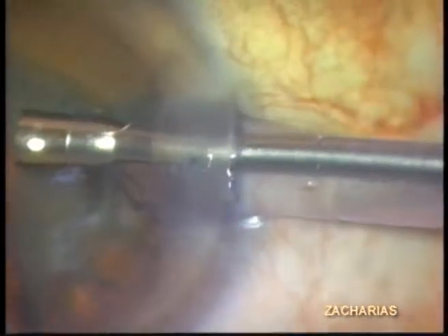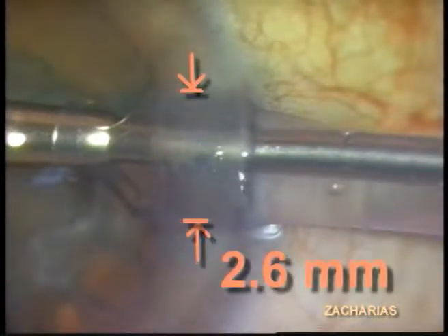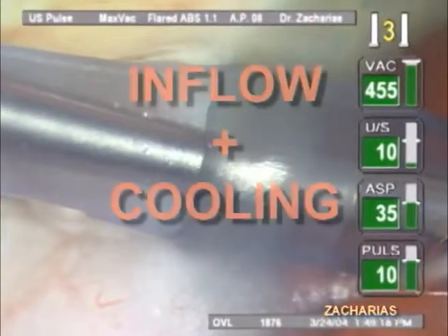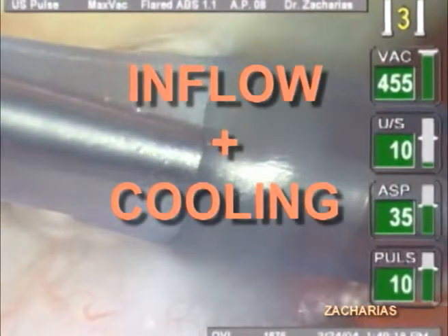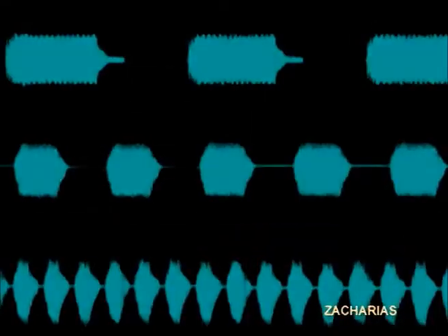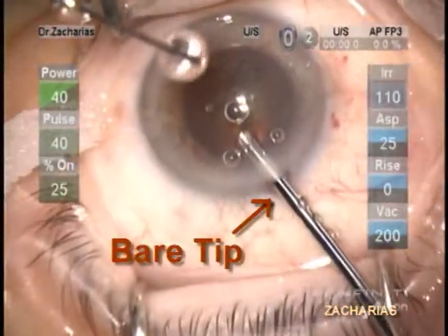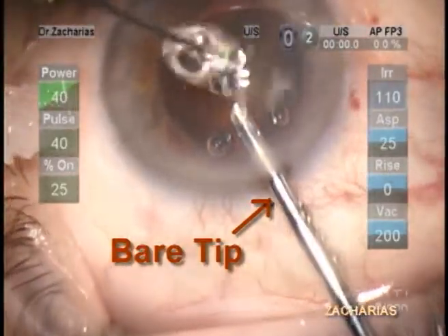Further reduction of incision size had been limited by the coaxial modality of irrigation aspiration, necessary to provide adequate inflow and proper ultrasonic tip cooling. Recent improvements in ultrasound power modulation allow the insertion of a bare phaco tip through a watertight incision without the threat of a corneal burn.